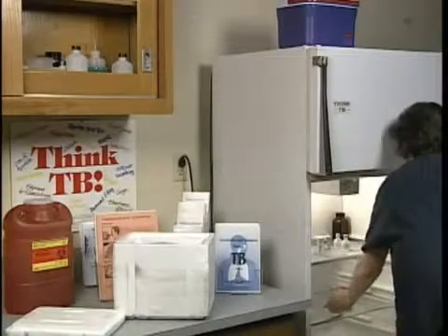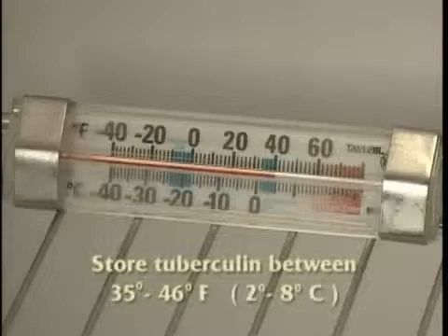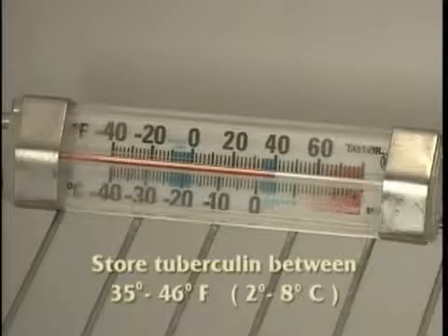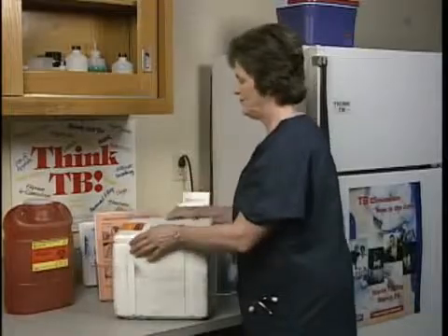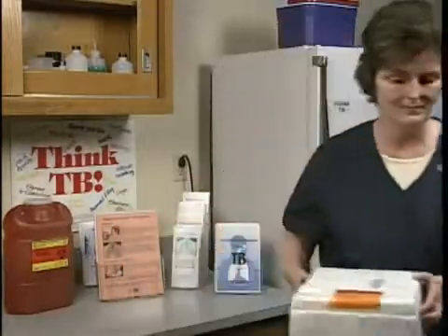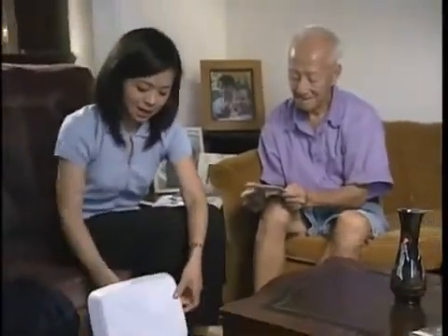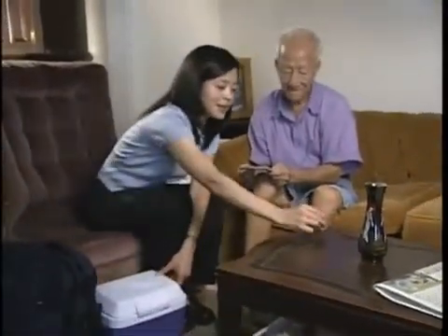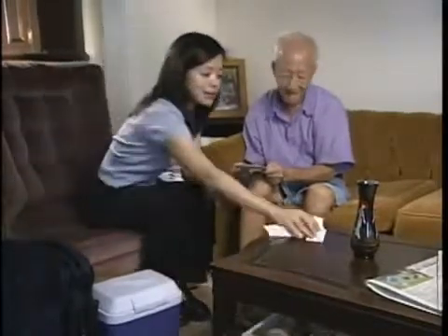To avoid reducing the potency of the tuberculin, store it inside a refrigerator so that it remains between 35 to 46 degrees Fahrenheit or between 2 to 8 degrees centigrade. Also, store and transport the tuberculin in the dark as much as possible and avoid exposure to light. In certain settings, such as when you're in the field, you may need to use another type of cooling container to control the temperature and protect from light.